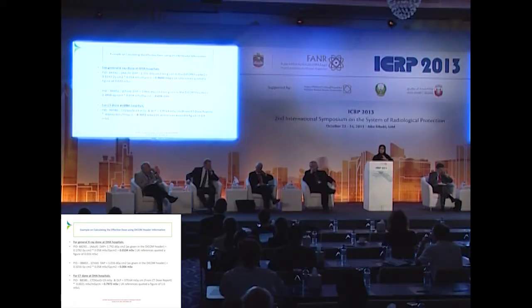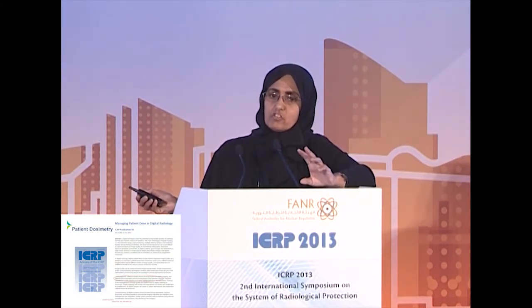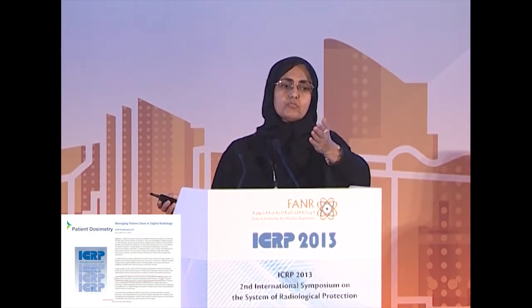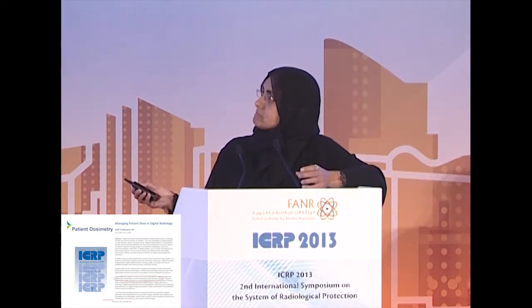Here I'm just showing a very quick example of what we have done in the DHA. We looked into the dose mentioned in the DICOM header, and we multiplied it by the coefficient factor, so we get the effective dose. And we compared it with other references published internationally. We found some correlation, but the main thing in this topic is that we have to verify the values given by the system by using phantom studies.